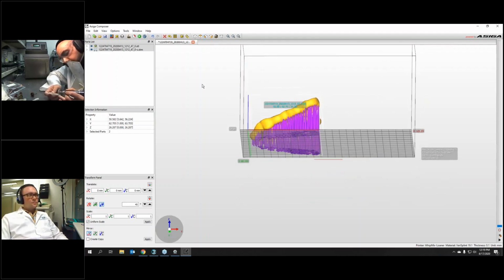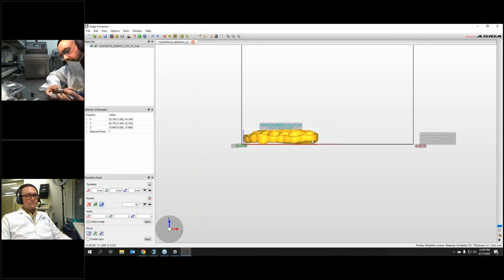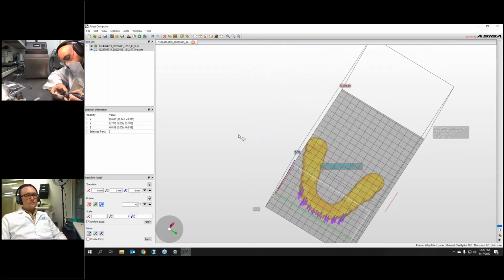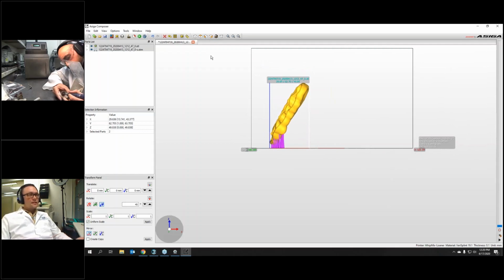Now, if we remove that and go to a 60-degree angle, so that's 60 right there, and we put on supports, there probably won't even be any in the posterior. Yeah. But the downside to this really is just that it's going to take longer.